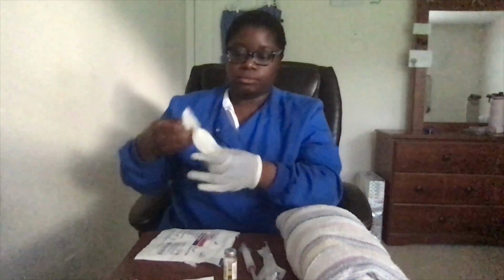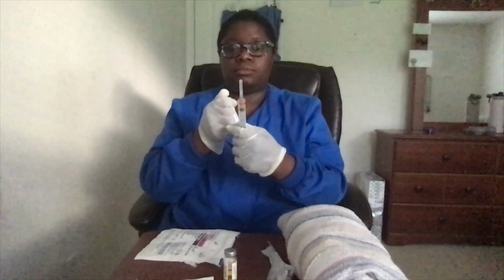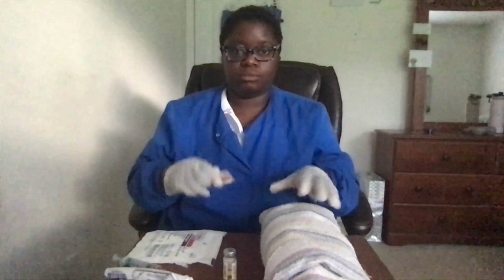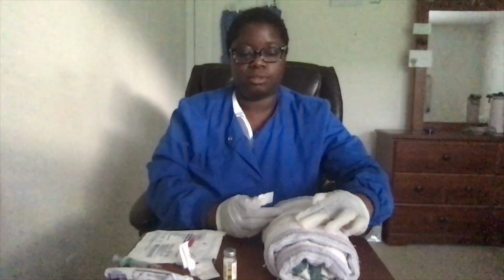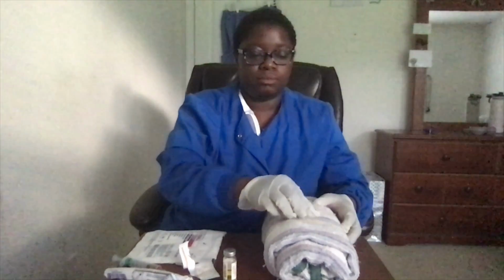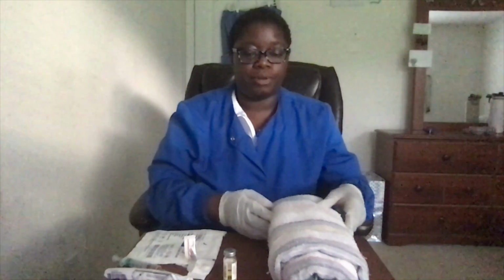Okay, Anna, are you ready? Okay. I'm now scanning your armband. And I'm scanning the medication. Here is her acromion process. My 2 fingers. The deltoid. I'm verbalizing that I have allowed this area to completely air dry before continuing.